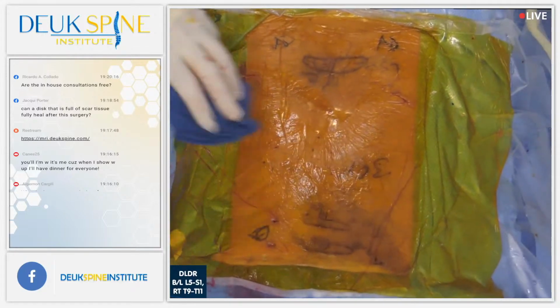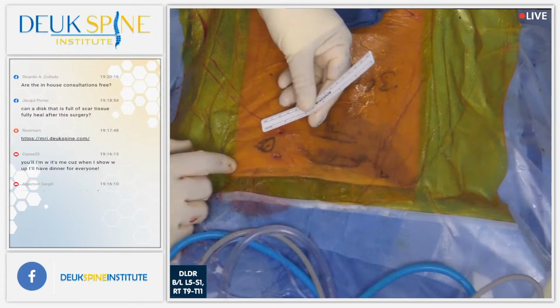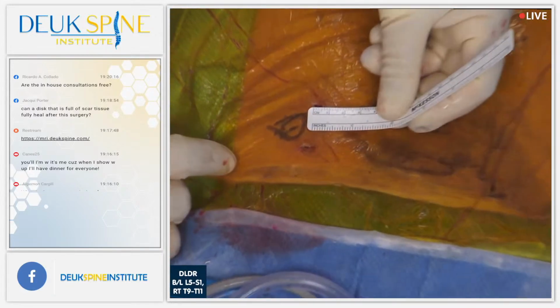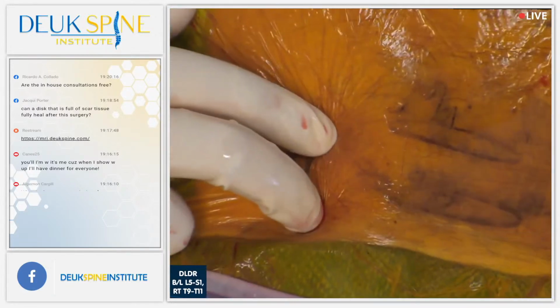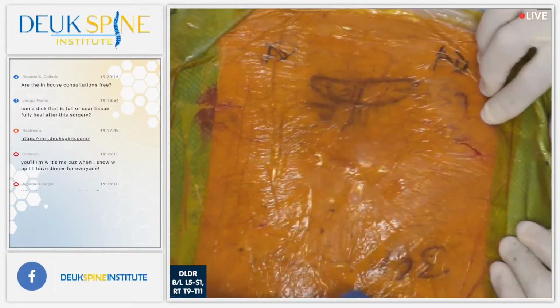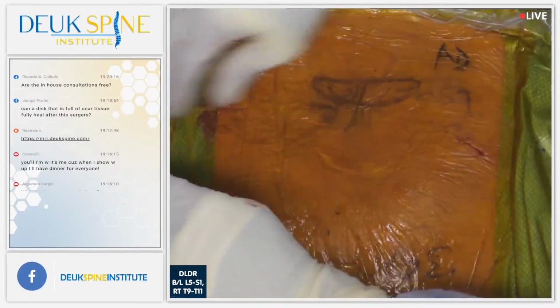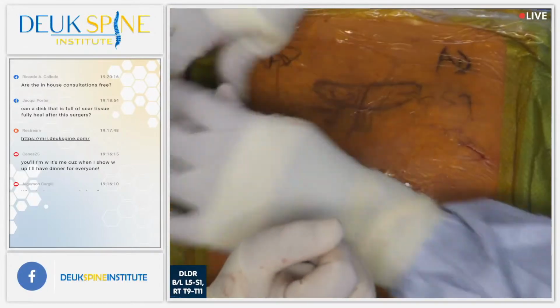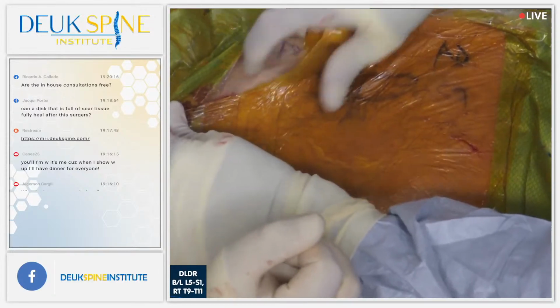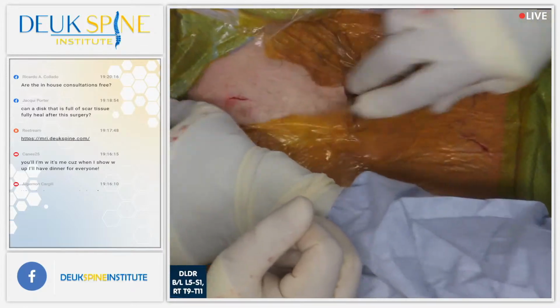All right, let's look at the holes. There's your holes. They are 7 millimeters each, okay? And we just fixed 2 thoracic herniations, T9-10 and T10-11, with only about 10 cc's of blood loss, 10 milliliters. I'll hold it. You go. The reason I'm putting pressure on the muscles is because the venous bleeding you see is bleeding from a vein, right?